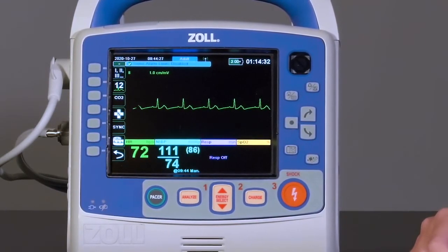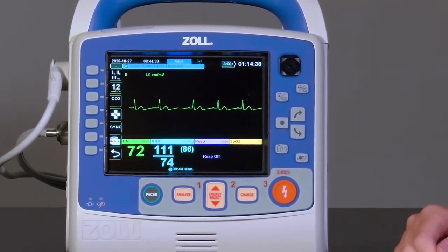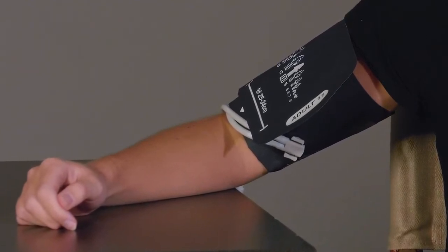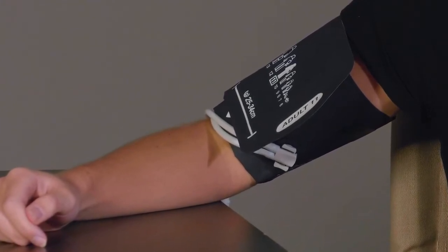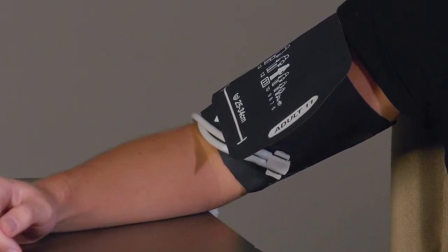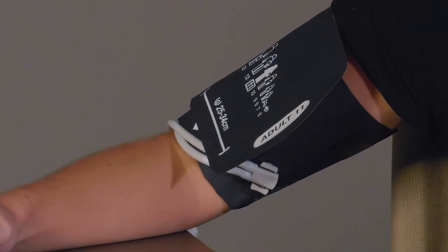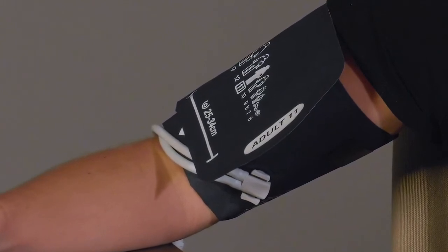If for any reason the system is unable to obtain a blood pressure on inflation, it will automatically attempt the reading on the deflation. The Smart Cuff technology is useful in helping the NIBP system mitigate motion artifact, such as patient movement or driving on a rough road surface. This feature requires that the four-lead ECG cable be attached to the patient. The Smart Cuff technology allows the system to synchronize NIBP readings to the R-Wave on the ECG, giving the system insight into what oscillations are likely from the patient and what oscillations are likely from artifact.